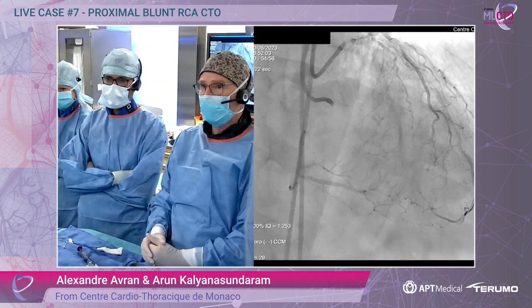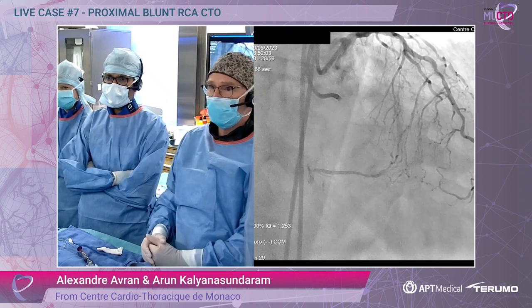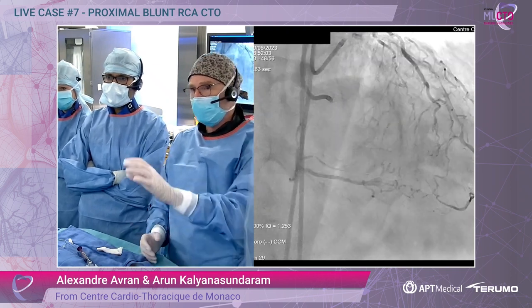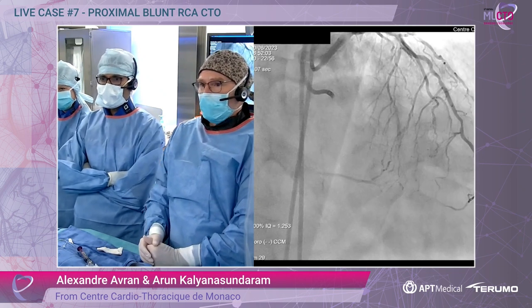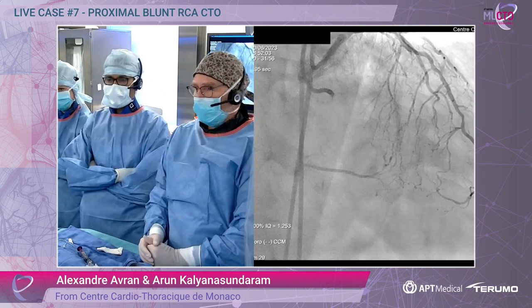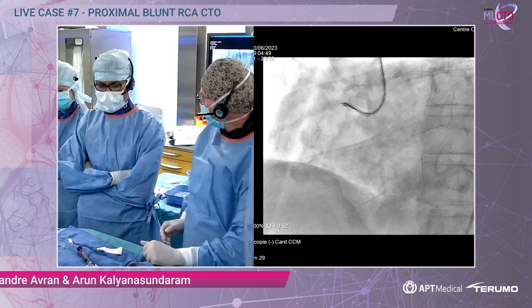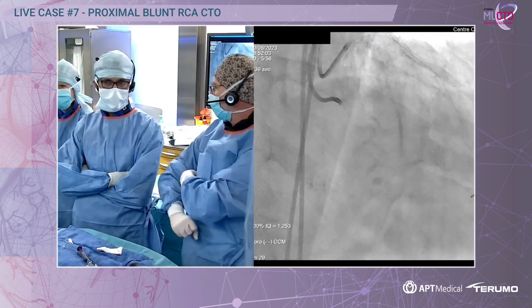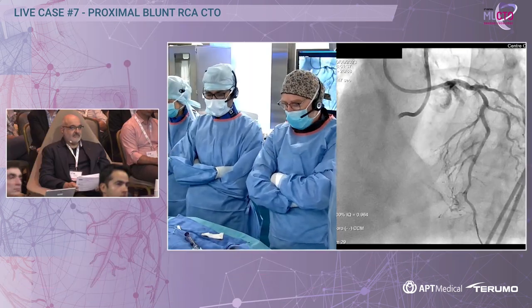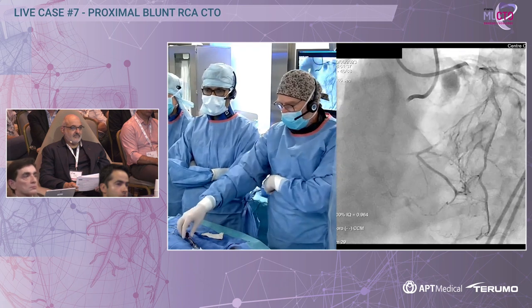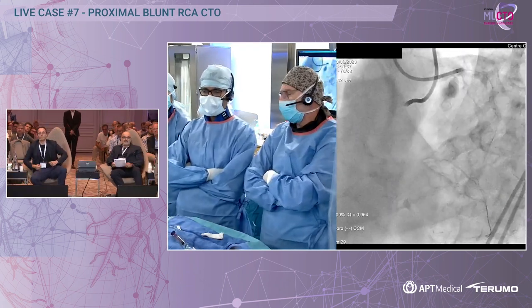We did a REO shot to appreciate the collaterals. So we elaborated with Arun our strategy — maybe you want to discuss it before, and then Arun will explain what we will try.